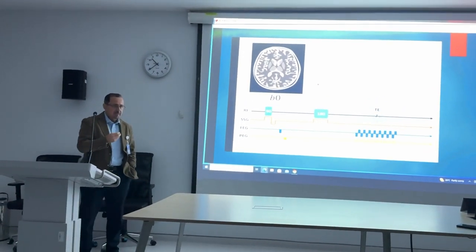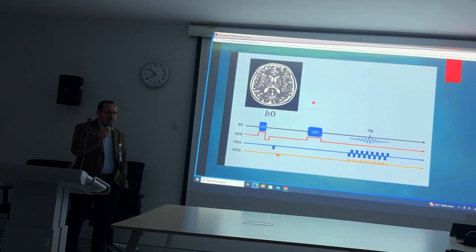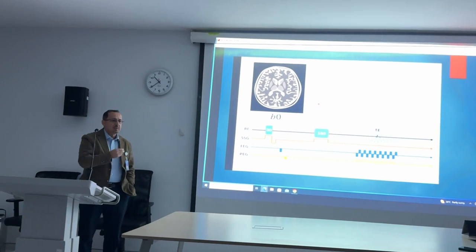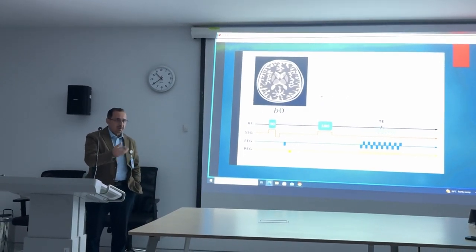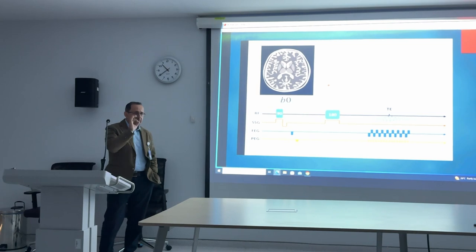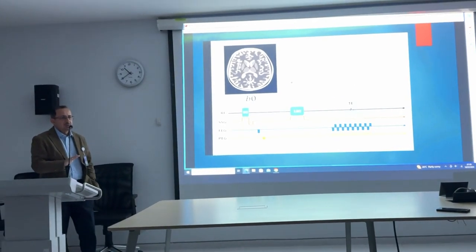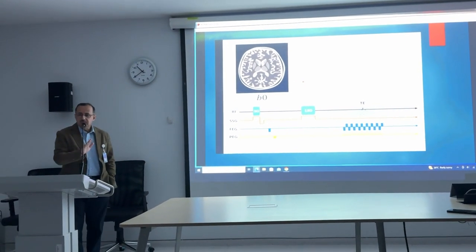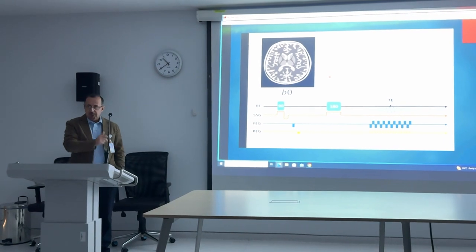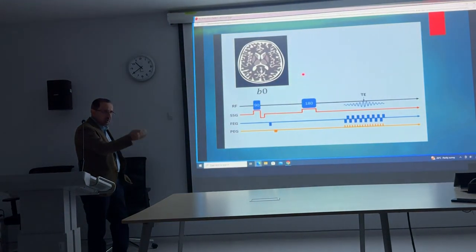Why is this markedly needed? Because diffusion is highly affected by motion. So motion of blood within vessels will affect the accuracy of the end result of diffusion. So we have to do the examination in a very short time, sequential imaging. This is mandatory to achieve a normal, accepted, or accurate result of diffusion imaging. Okay? We will not go for long procedures. So we depend on echoplanar type of imaging. You will see that when we go for the diffusion, we'll further accelerate the time and shorten it more.